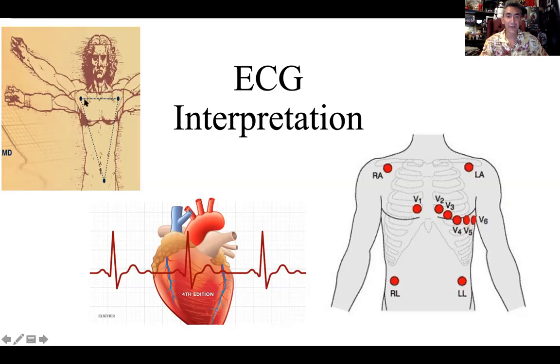So we can have an electrode, electrode, electrode. And realistically, they would be placed on the wrists and on the ankle, right? And what we're trying to do is make a triangle. In a lab setting, we don't want to be too invasive. So most people have exposed wrists and maybe just pull the pant leg up to expose the leg. In a hospital setting, again, you sign consent and this kind of stuff. So they can be a little bit more invasive.